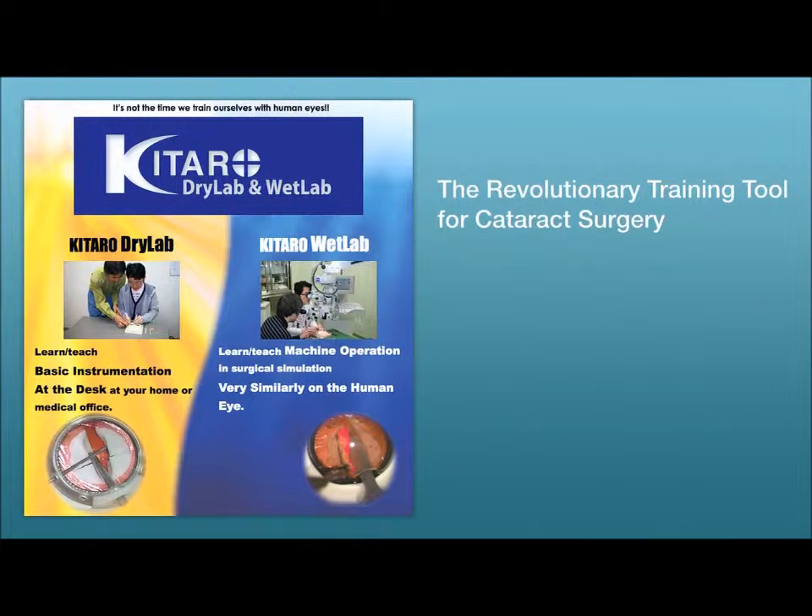FCI Ophthalmics demonstrated its brand new cataract training system at ASCRS. The Kitaro system contains all items necessary for both dry and wet lab practice.